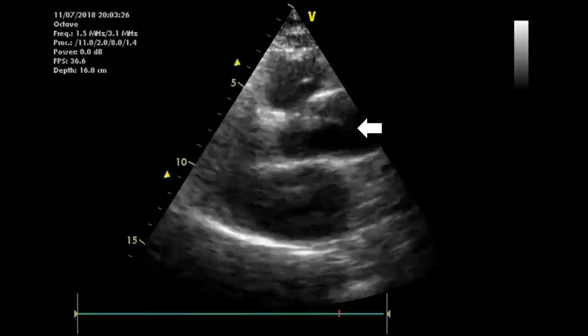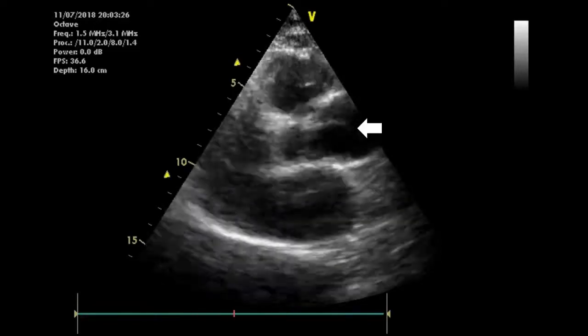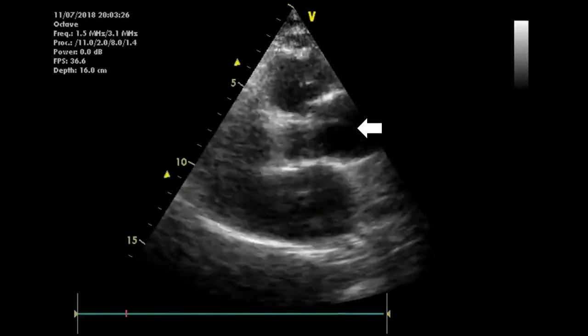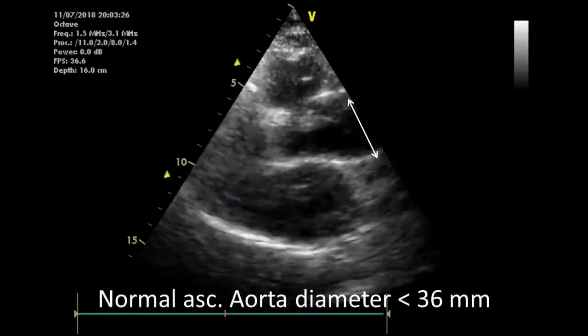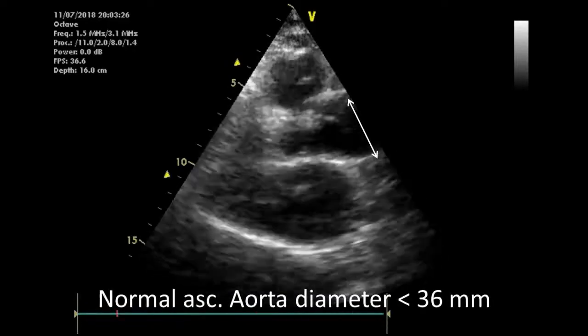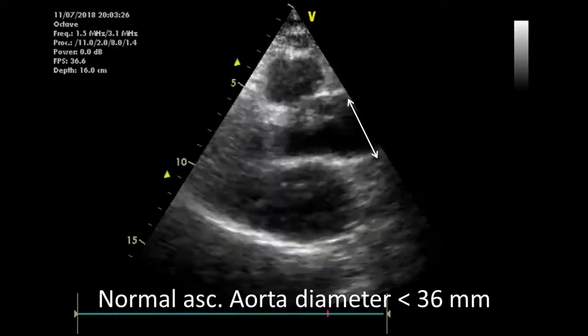Sometimes there will also be an exit tear back into the lumen, and then you can see a jet of blood flowing back into the lumen. In most cases, you'll also notice a dilated aorta. Normal ascending aortic diameter should be less than 36 millimeters. You can measure it using the caliper.